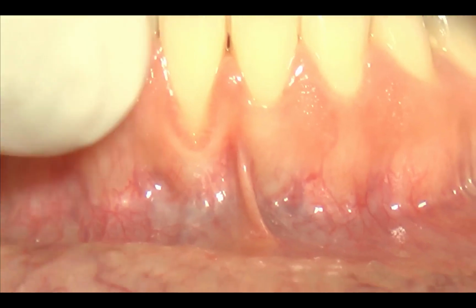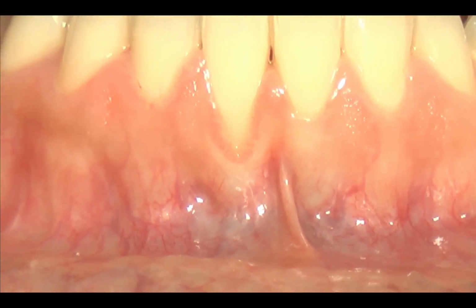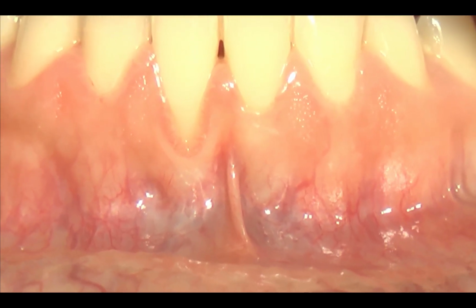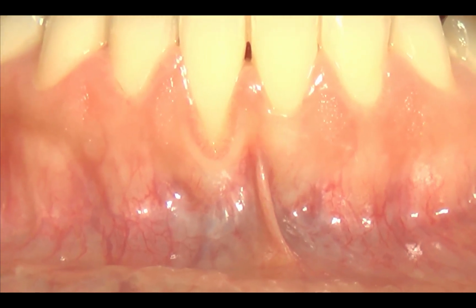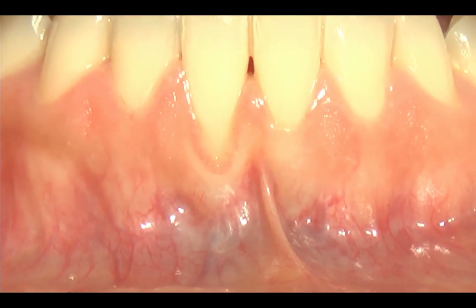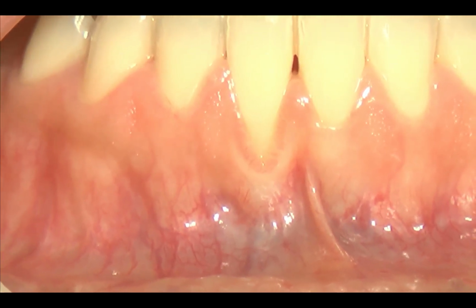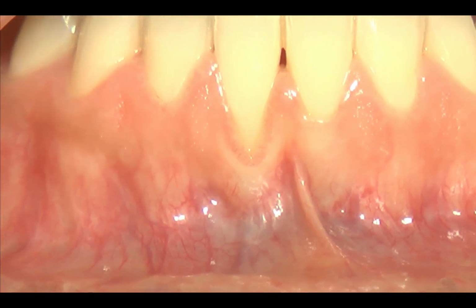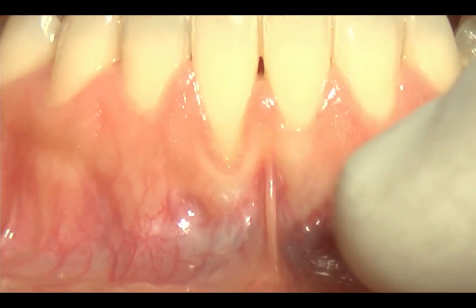And so, since I have to make a bilaminar approach, namely a flap plus a connective tissue graft, I always prefer to take the flap from the keratinized tissue remaining apical to the gingival recession in order to make a first intention wound healing and not leave an area healing by secondary intention as it happens when you make a sliding flap. Obviously here we have some other problems like the presence of the frenulum.